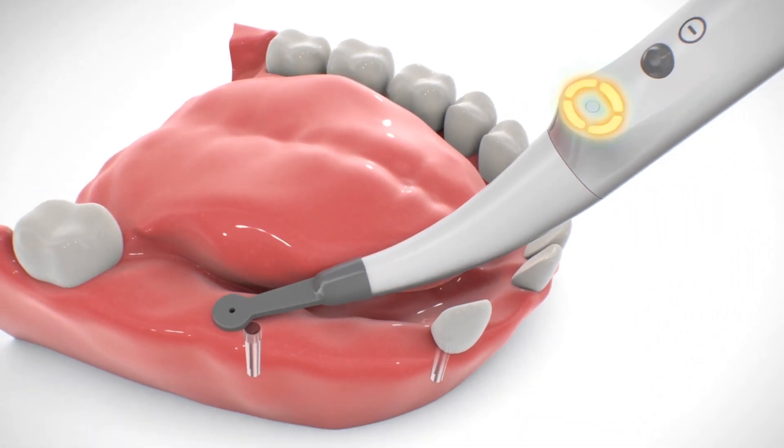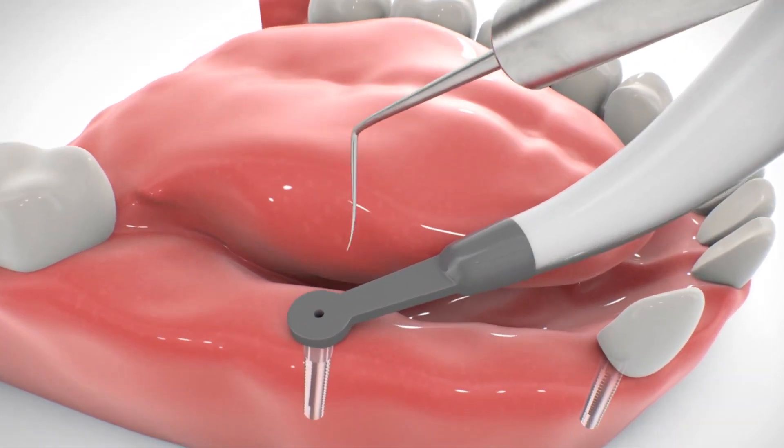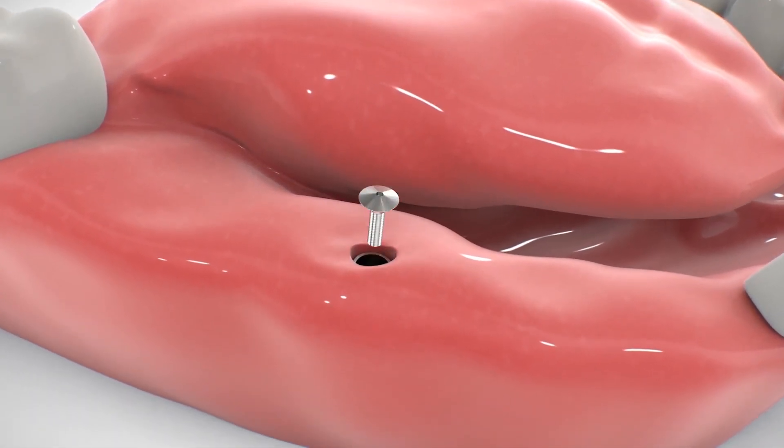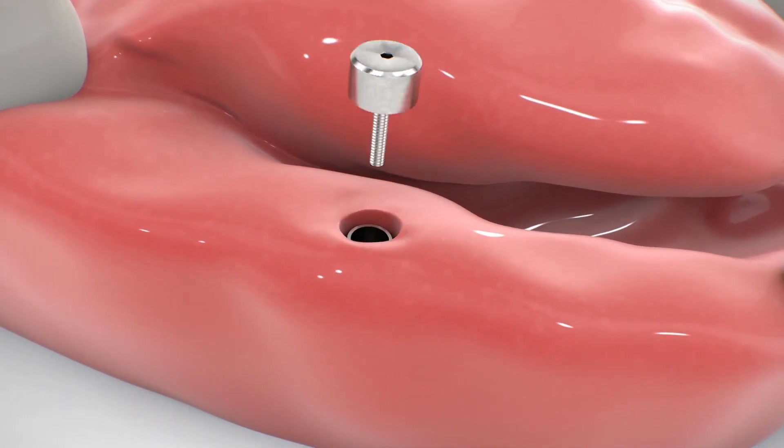For implants located in the molar region, it may be more convenient to scan the gums lingually.